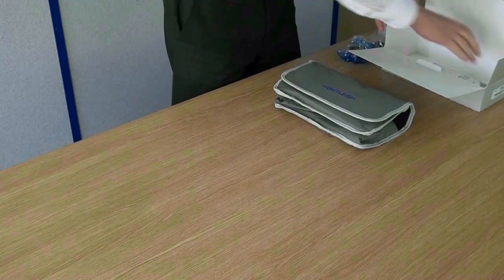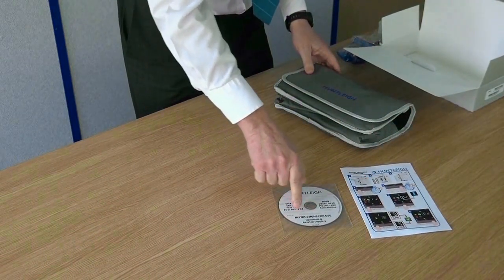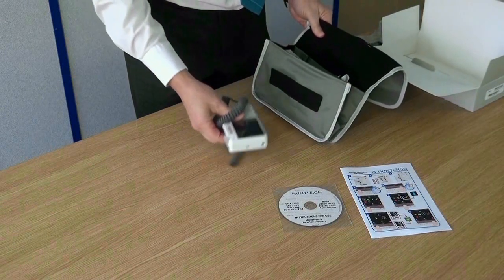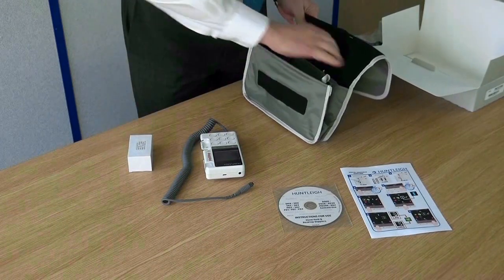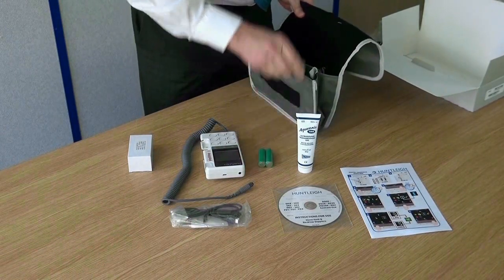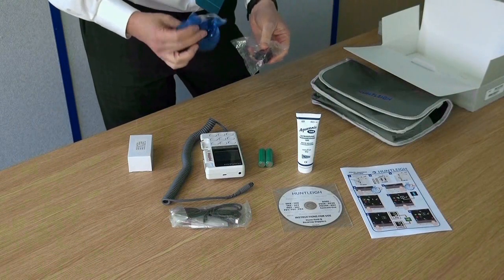The Rechargeable DMX Digital Doppler comes with a quick reference guide and instructions for use CD. The Doppler unit, charger, gel, USB cable and rechargeable batteries are enclosed in the carry case. The rechargeable version also includes the different adapters to suit your local power outlets.